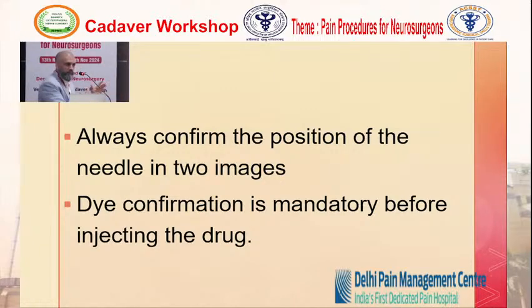Now this is again which is often asked: dye. Dye confirmation is a must. We follow the basic principle: wherever there is dye, there is going to be drug. You might get a perfect image, but if they are not putting in the dye and the dye is not getting good spread, that is one. Second, dye spread is needed to rule out any sort of complications.